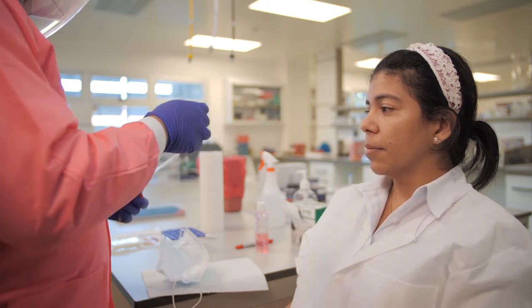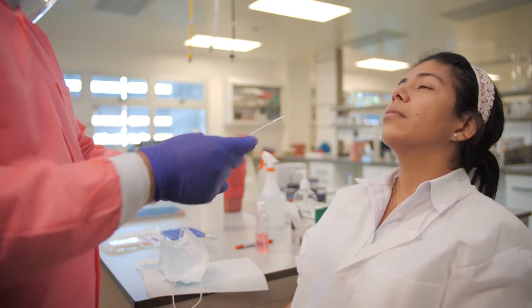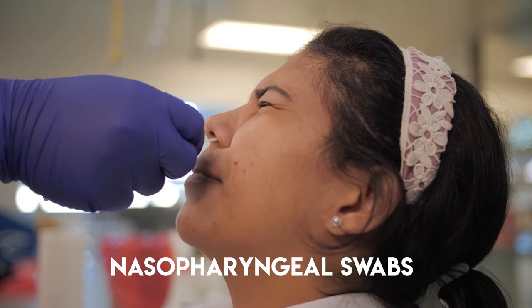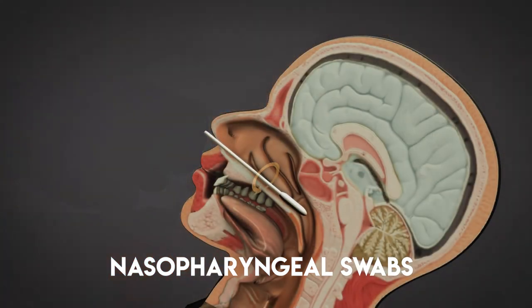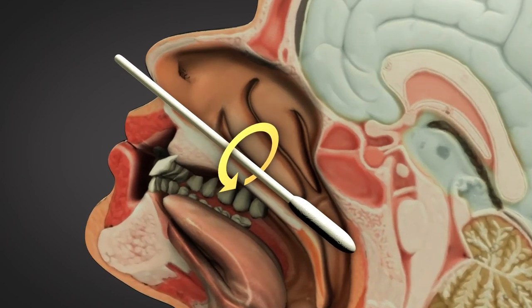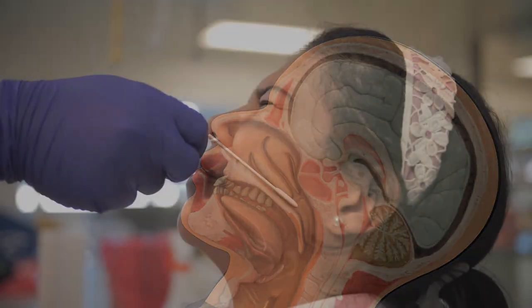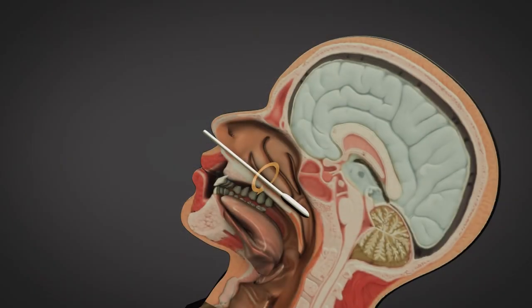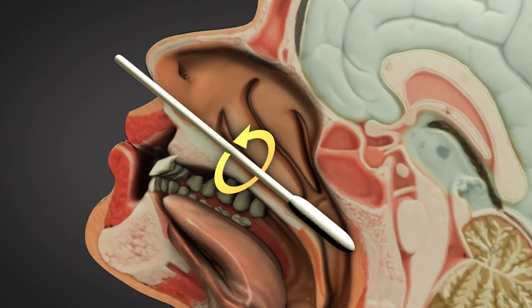Remove the nasopharyngeal swab from its packaging and insert the swab into the nose, parallel to the palate — not upward — until resistance is encountered, or the distance is equivalent to that from the ear to the nostril of the patient, indicating contact with the nasopharynx. Note that closing the eyes and/or tearing is a normal response. Gently rub and roll the swab, and leave it in place for several seconds to absorb secretions before removing.